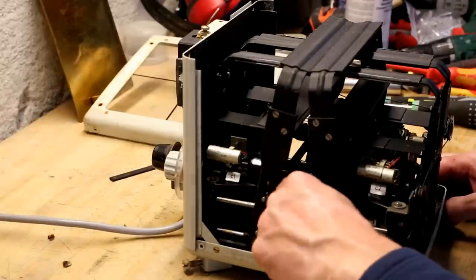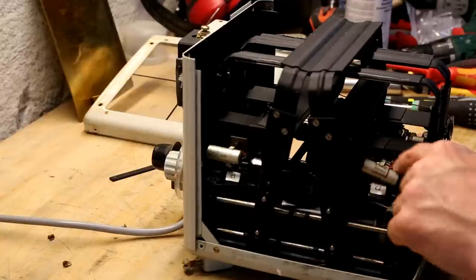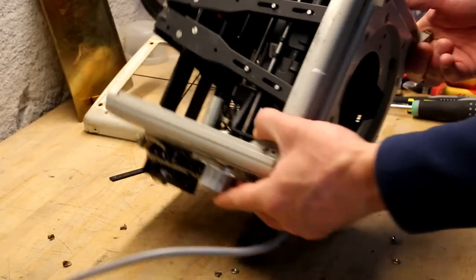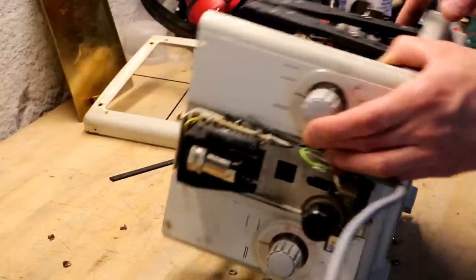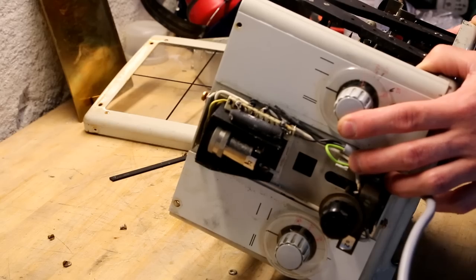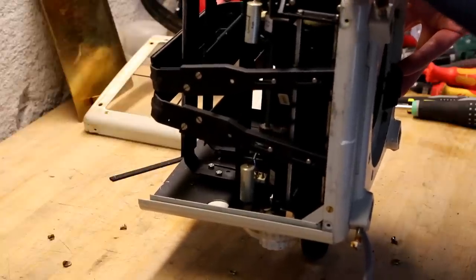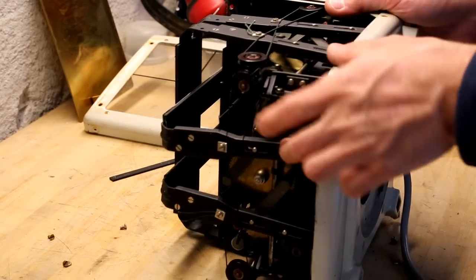I'm not sure what that cylinder there is, but there are two cylinders with, these are just the contacts. I'm not quite sure why it would have what appears to be a motor. Okay, it's not connected. There's actually a gear missing here. As you can see, there used to be a gear here, so this is just turning free. Same over here. Nothing is connected to the cylinder or motor here.